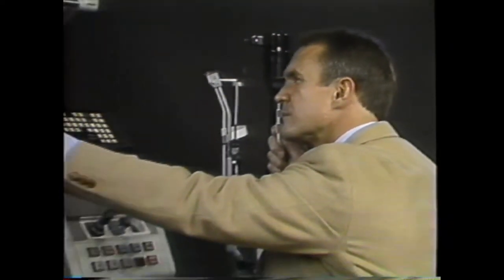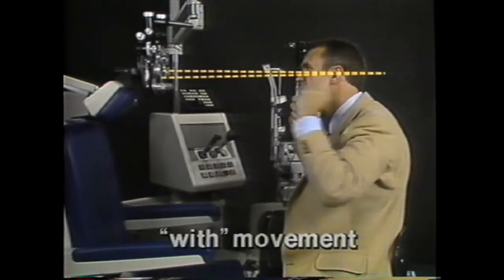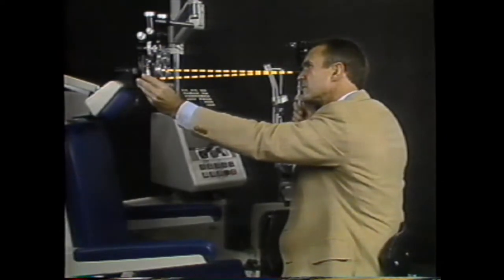How does one know where the far point is? By the movement of the retinoscopic reflex. If you see with movement, the far point is beyond the retinoscope, and plus lens power is added to pull the far point into the position of the retinoscope.